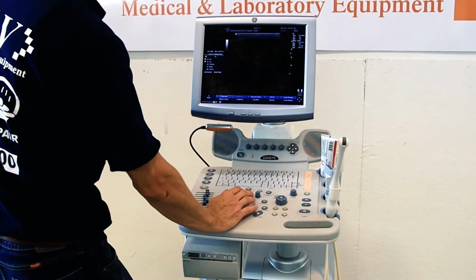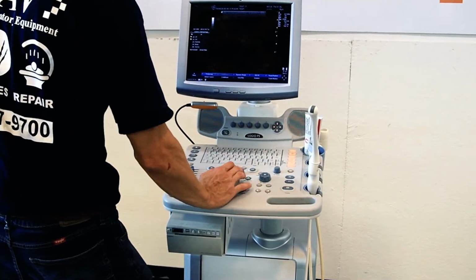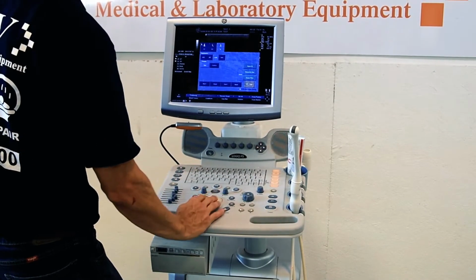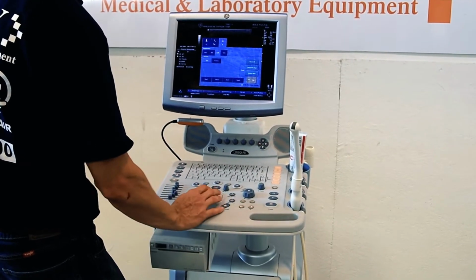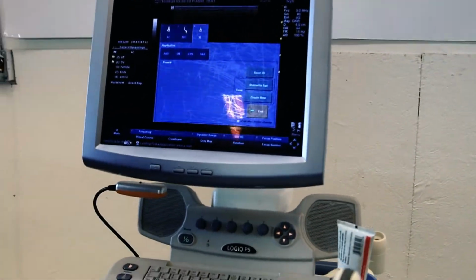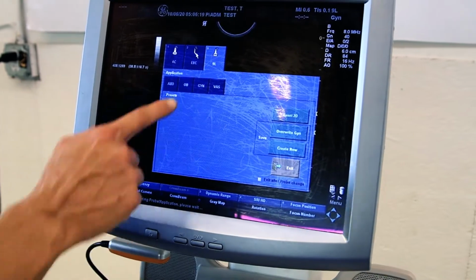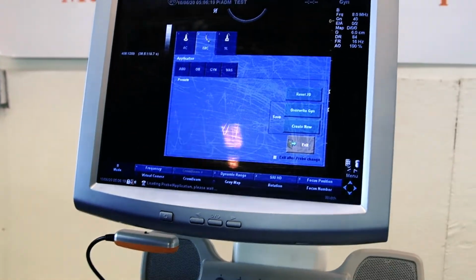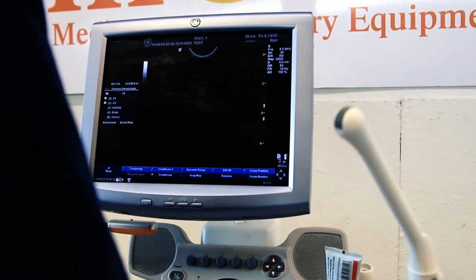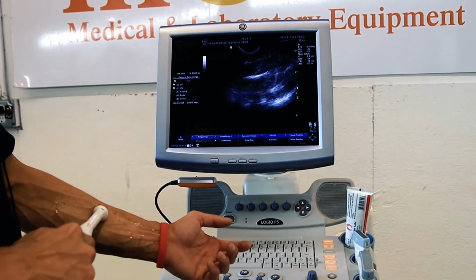And then of course we have one more with this particular unit, the transvaginal transducer. We'll go ahead and do the same thing, hit the probe, come up here, select the E8C, and give it a moment to transfer over. Once it selects it, it'll highlight it there. Come down to exit, and you will be able to use the additional item here.